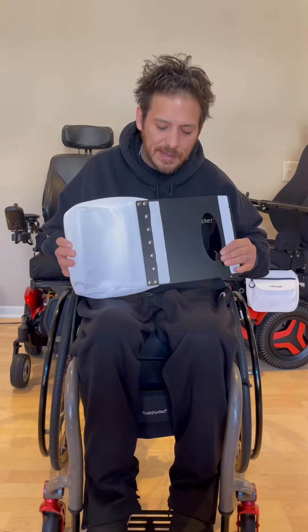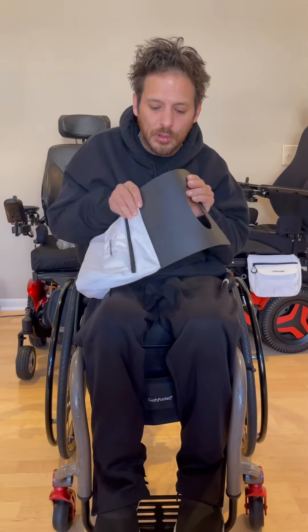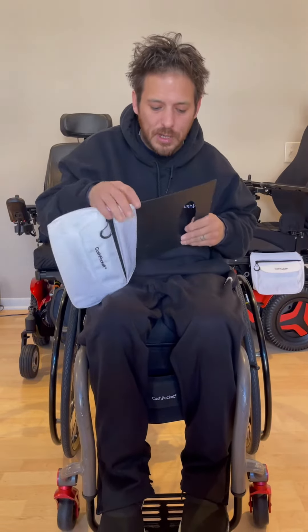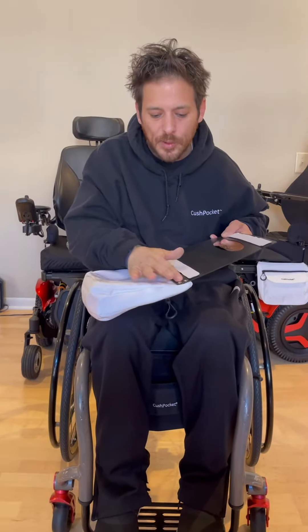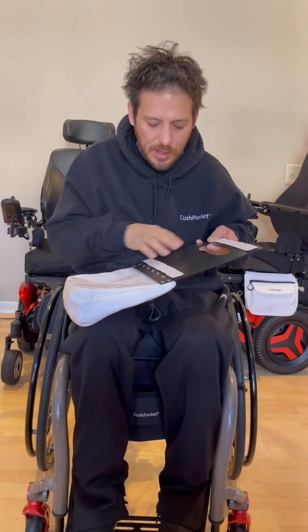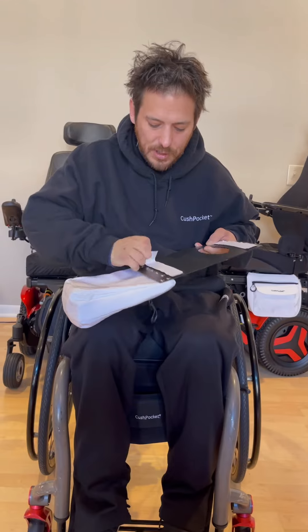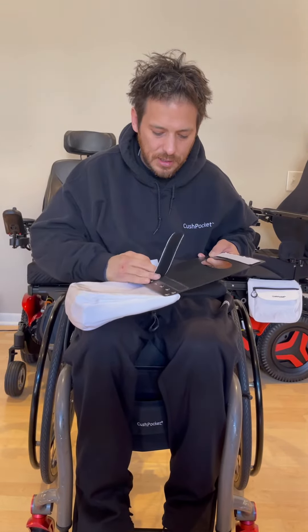I designed it connecting to this board here — it's a bendable, durable board with a handle hole to carry. I designed it with these smooth rivets to connect the bag to. Also, with two pieces of velcro you can easily attach it to your chair where you need it to be.